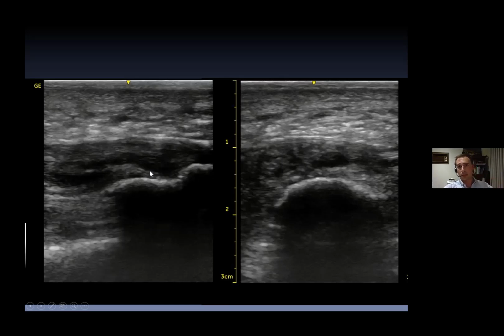When someone develops an intrasubstance tear, it's almost 95% of the time right here, because you get a compression functionally as the fascia wraps around the heel bone. You get a compression in this area, and that starts to break down the fascia. And you see the same thing with Achilles insertional tendinopathy, the Haglund's deformity. It's the compressive load from that heel spur. So the shockwave doesn't fix the spur, but it does help with the damage that's caused from the spur itself.